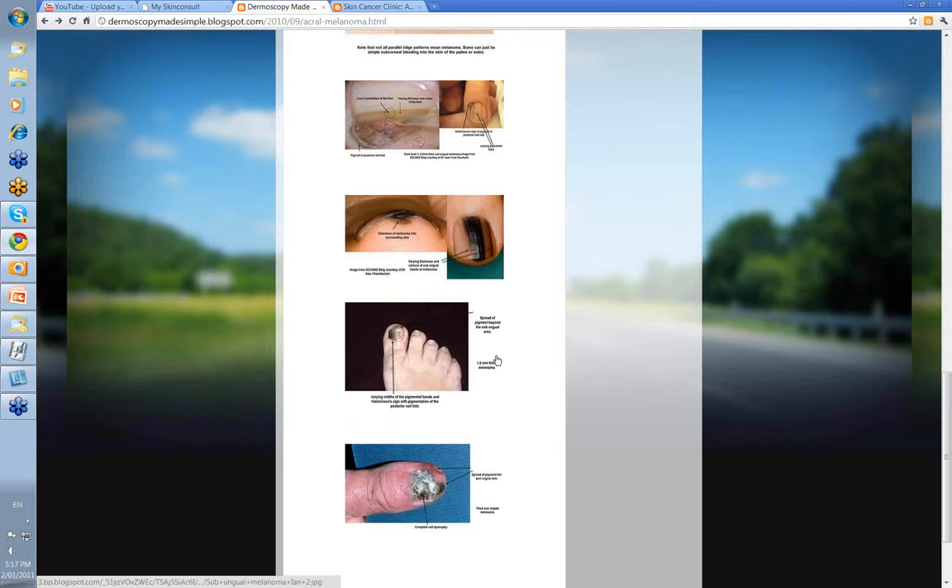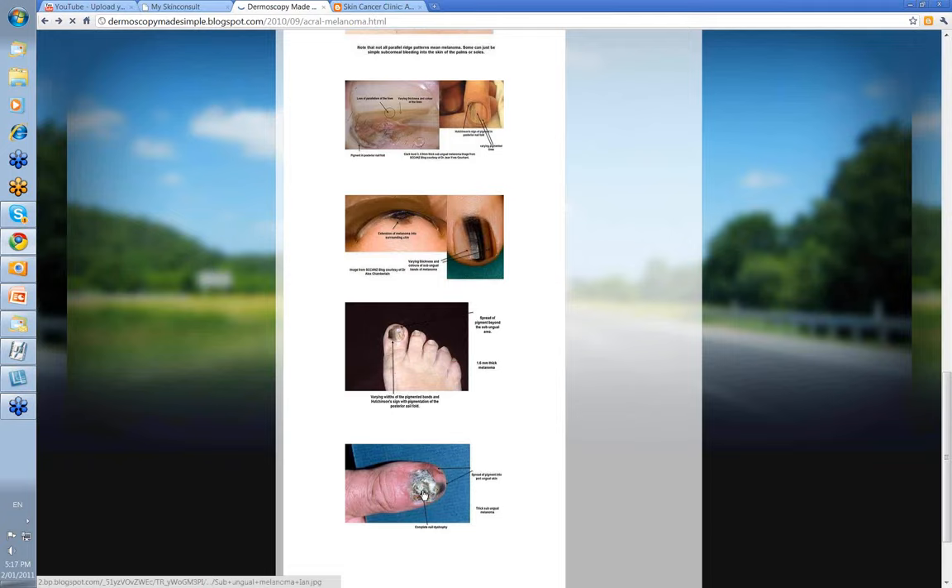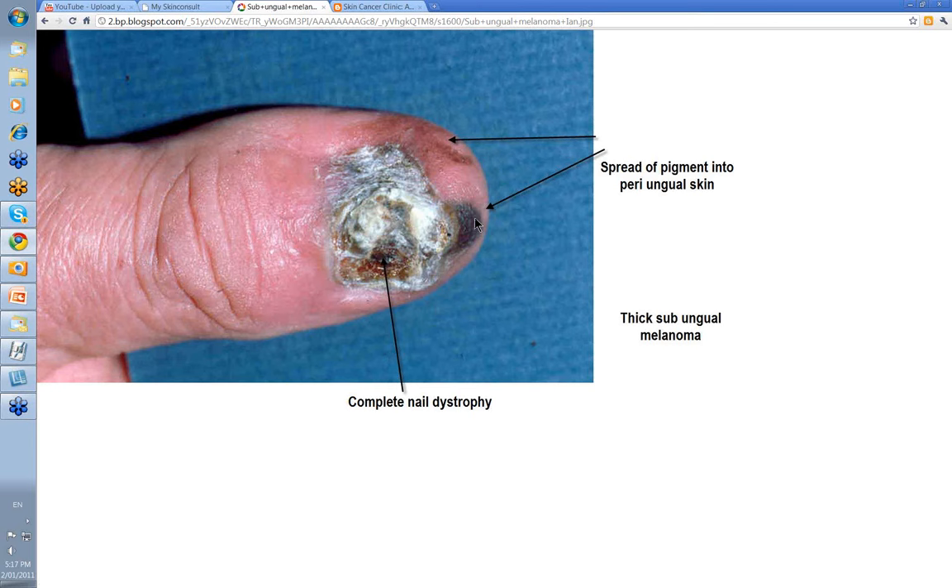A gentleman I saw before I had my dermatoscope — you can see the varying thickness of lines, the nail dystrophy, the extension of pigment onto the surrounding skin, and the prominence of pigment at the posterior nail fold. In this other case, you've got complete dystrophy of the nail from the melanoma, extension into the skin, and bleeding into the surrounding skin. These cases generally require amputation through the DIP joint, but often they're quite delayed in diagnosis — 2, 3, 4 millimeters thick before they're picked up, and often having already spread.